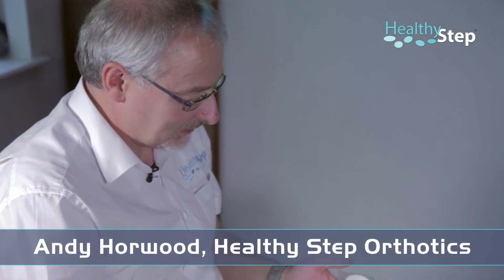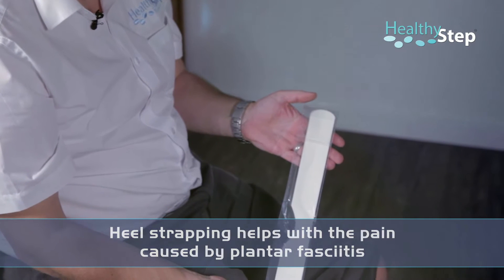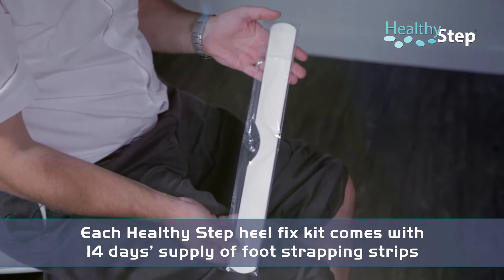Here's the Heel Fix Kit taping technique, which is a great way of reducing pain in your heel associated with plantar fasciitis. Inside the kit is a 14-day supply of tape, one for each day for the next 14 days.